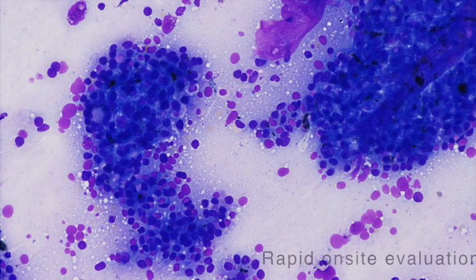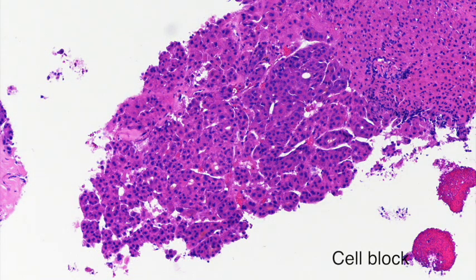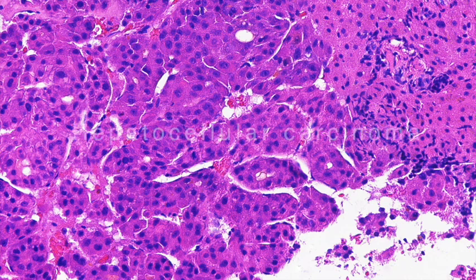Rapid onsite evaluation revealed malignant cells, which was confirmed to be a hepatocellular carcinoma on cell block.